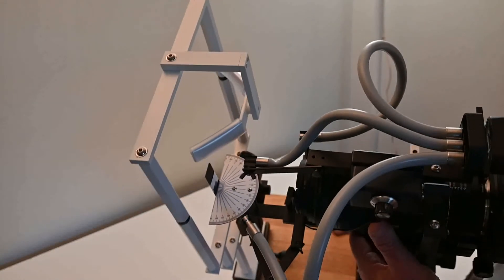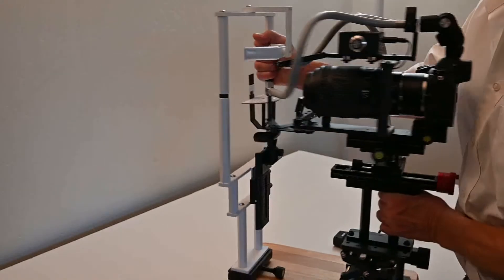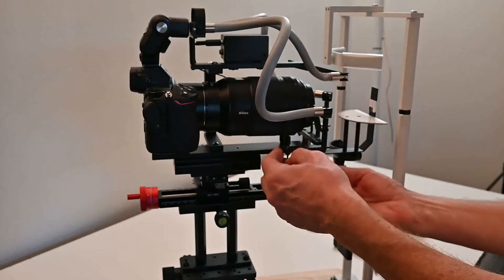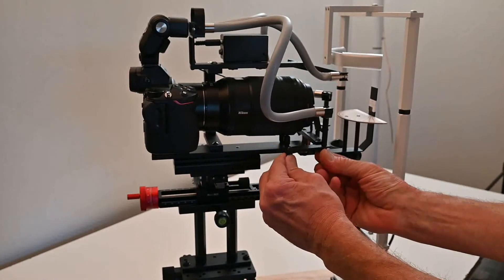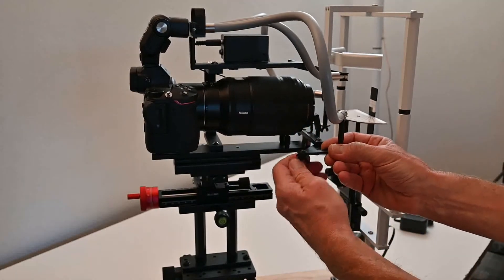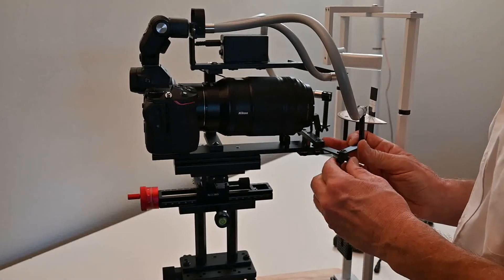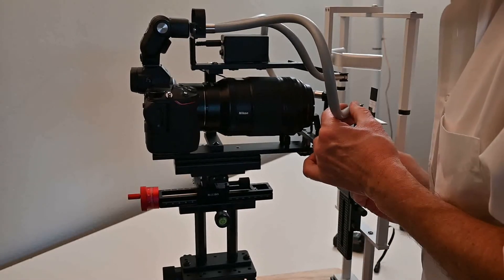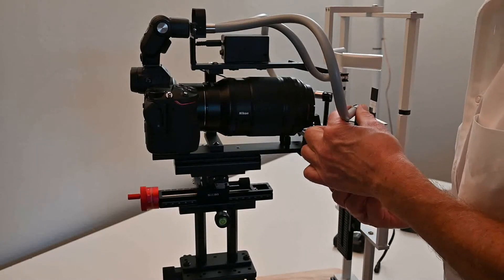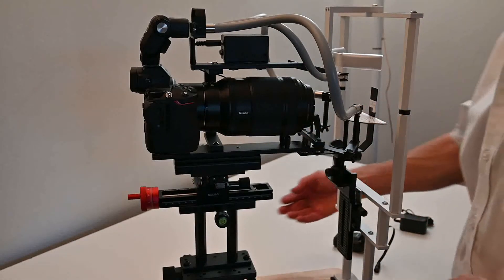The left side is now perfectly aligned. For the right side it's the same process: loosen just a fraction of a turn, adjust distance and angle. Start at 45 degrees, position accordingly, then tighten the three screws so both lights point straight at the iris.